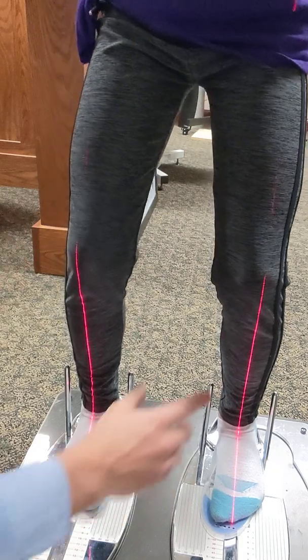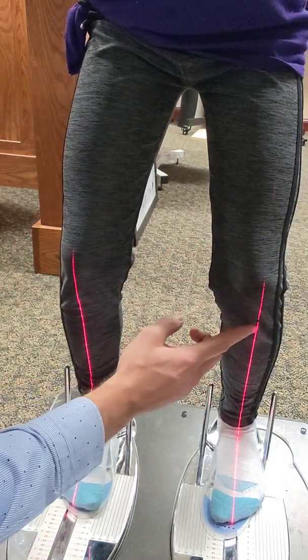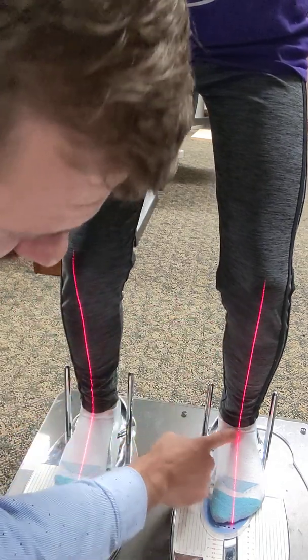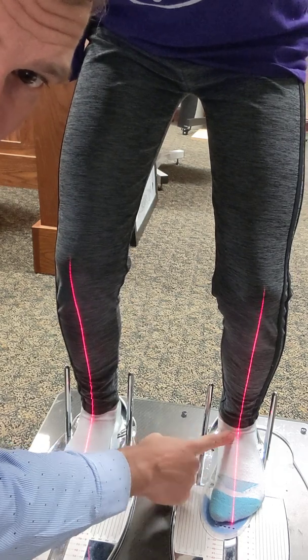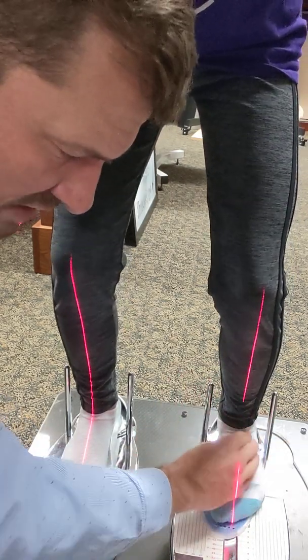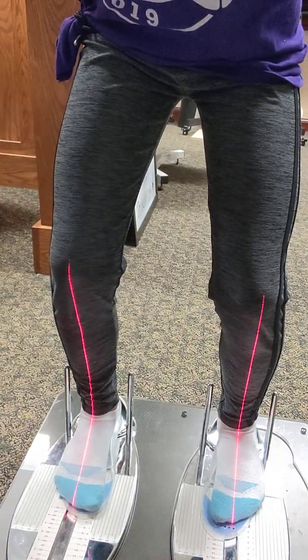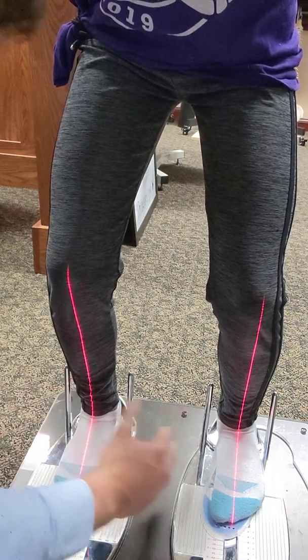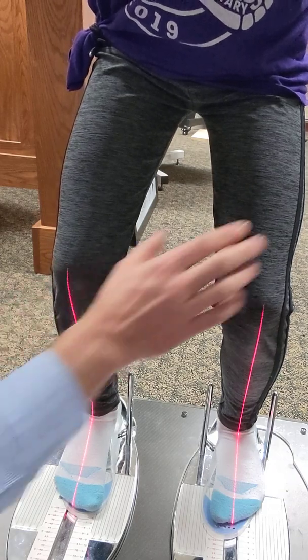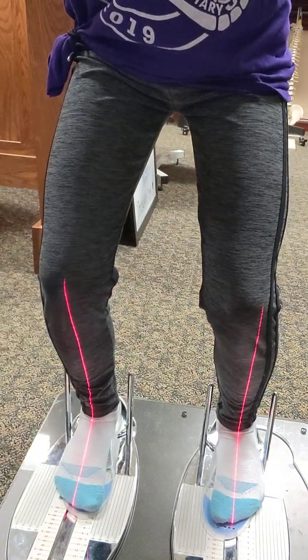Now you can see where the lasers are coming. We've moved this midline in towards the knee — same thing this one. This one's spot on perfect, and this one's doing a pretty good job too. Look at what happened down here — that laser is now the middle of the foot in mid stance. That's really important. So we know now at mid stance she's in a really biomechanically favorable position. This is what we would do for Kai's orthotics — these will be in her shoes now, really loading the inside of the leg versus just the outside.